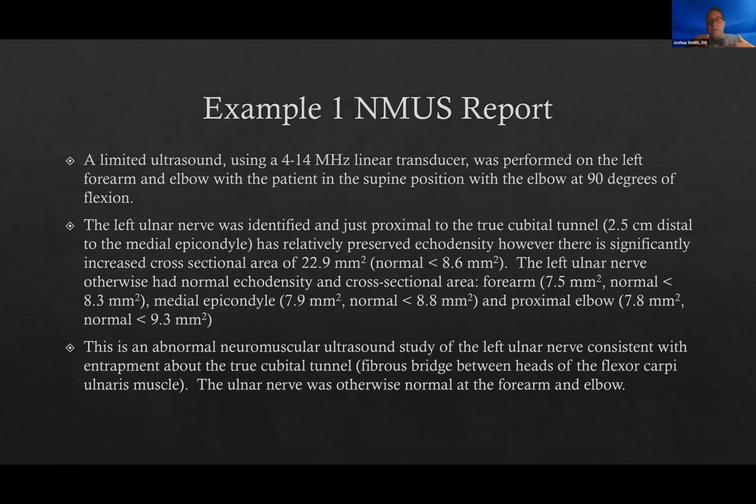The ultrasound isn't going to as easily give you that information. So I think it's more something you can add on, and that's why I like it being part of the EMG lab. You can add it on when you think it's going to help your patient and provide some more information regarding that.